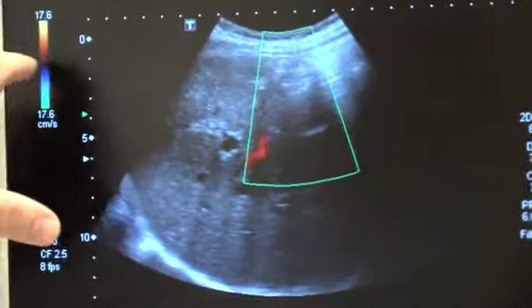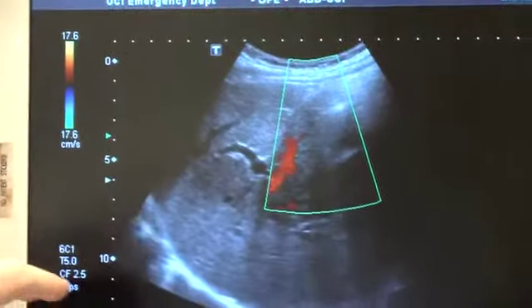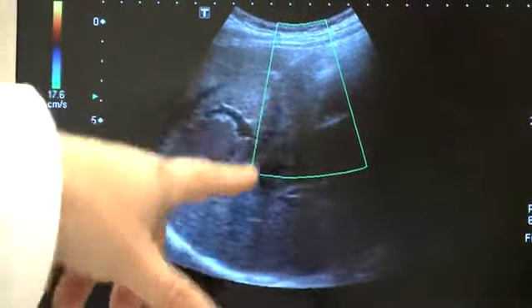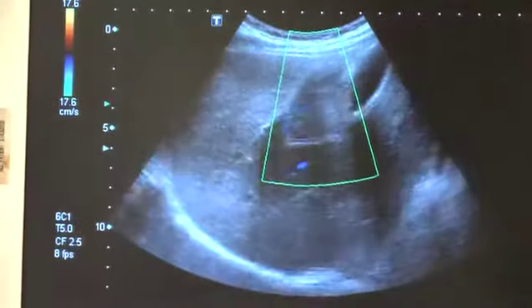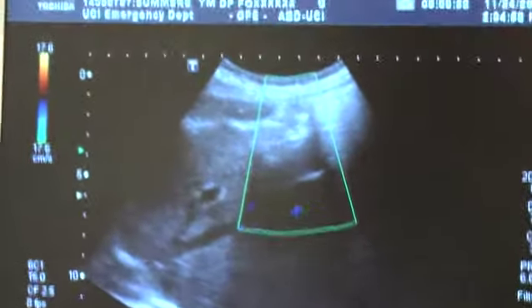It doesn't mean venous flow. It just means the blood in the portal venous system here is flowing away from the probe, whereas the red and yellow means flow is coming towards the probe. So the color Doppler gives us information on flow, yes or no, and directionality. Blue away, red towards.